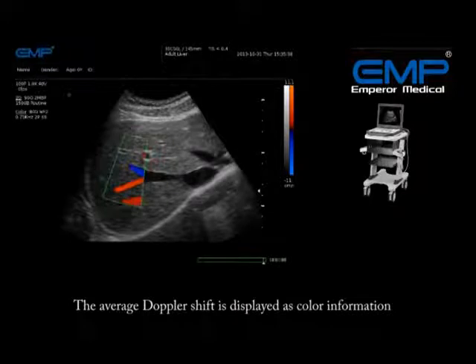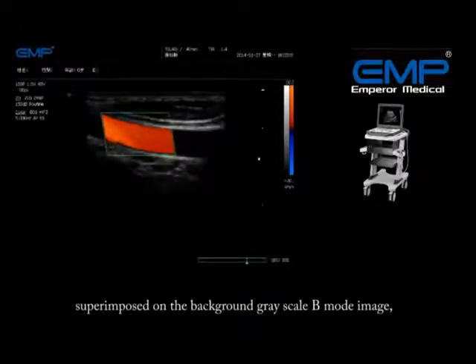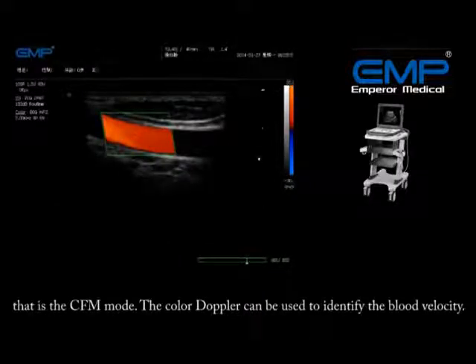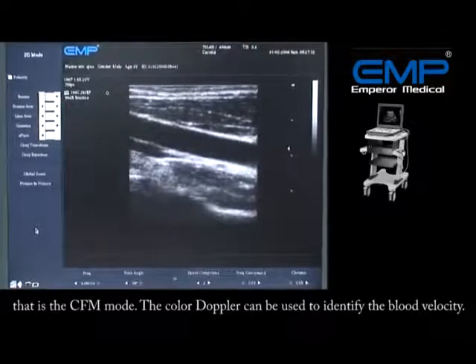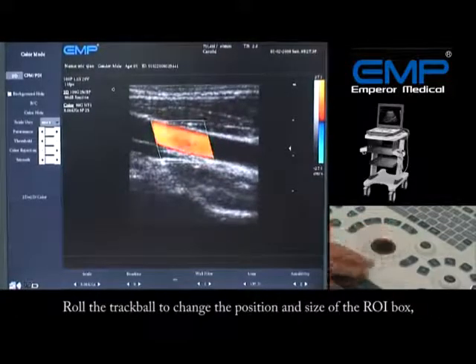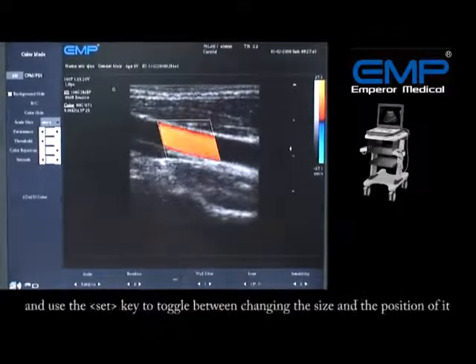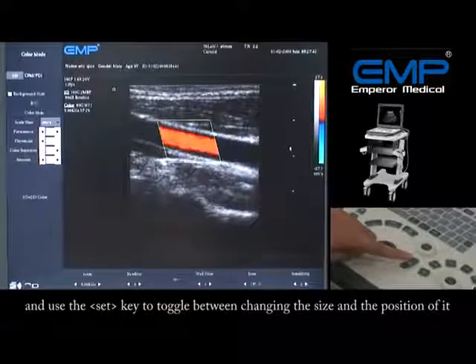The average Doppler shift is displayed as color information superimposed on the background grayscale B-mode image — that is the CFM mode. The color Doppler can be used to identify blood velocity. Press the CFM key to activate color blood flow. A ROI box will appear on the screen. Roll the trackball to change the position and size of the ROI box.